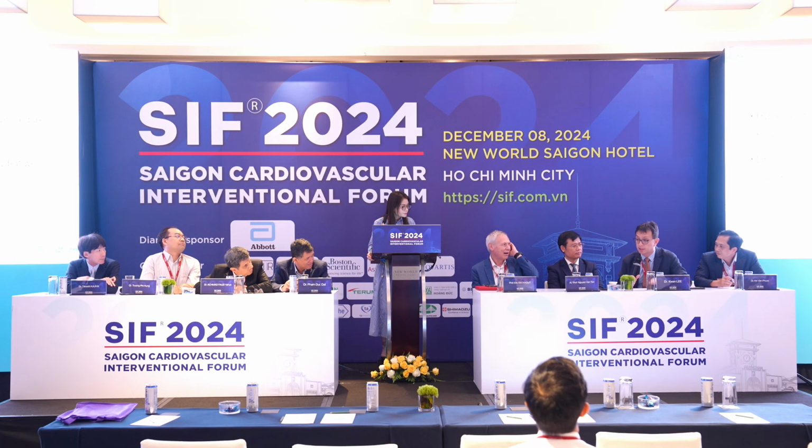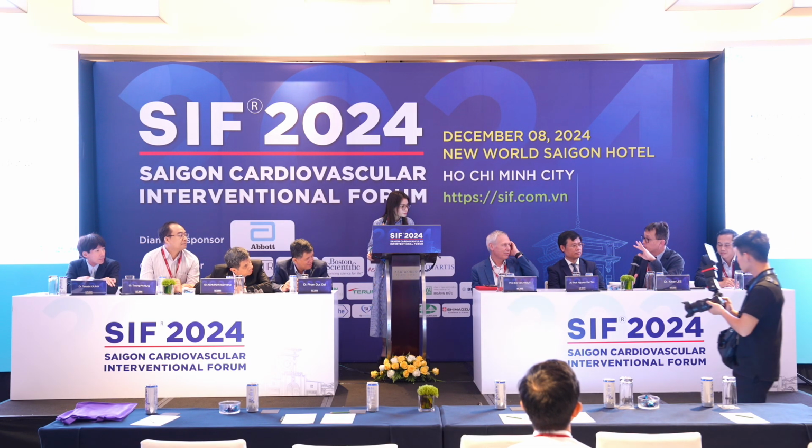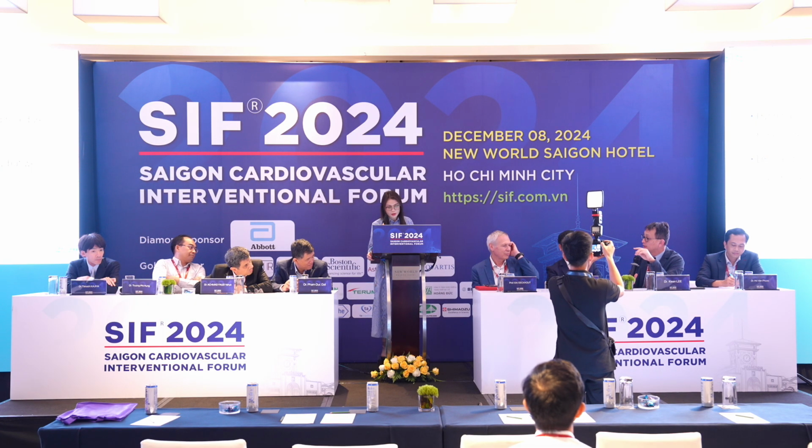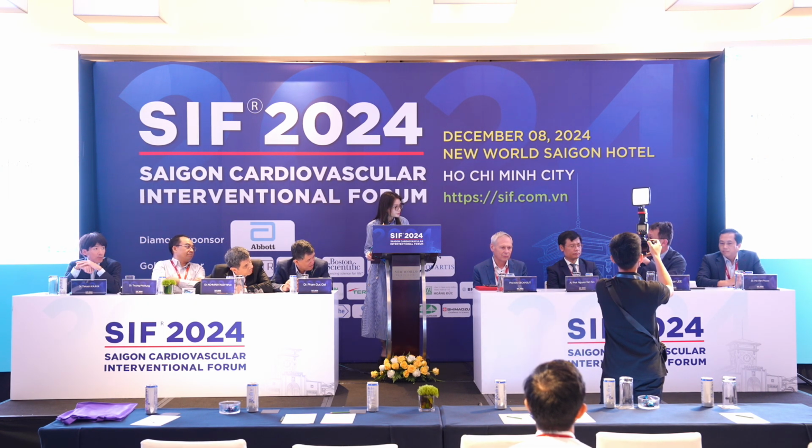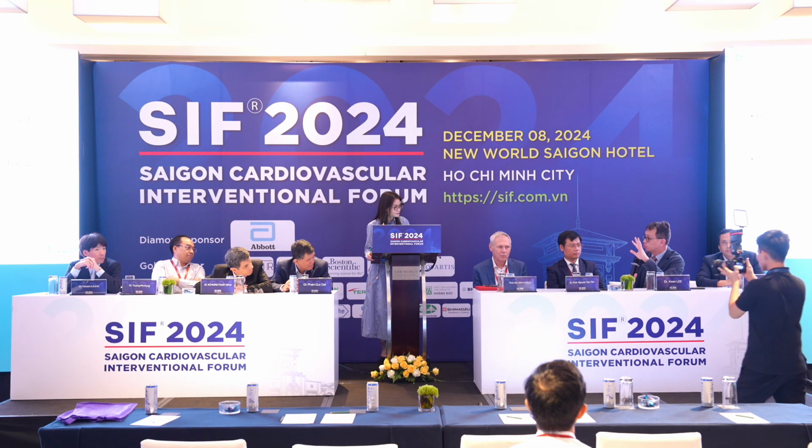I think, obviously, both your cases were actually trifurcation cases. Even though I think your first case, you called it a bifurcation case and you didn't protect the OM, I think it would have been useful to protect the OM with a wire. Understanding that you're about to take on a trifurcation and having all the appropriate guide size backup, it was very elegant what you did with the two guide technique, and there's no data for that, obviously.